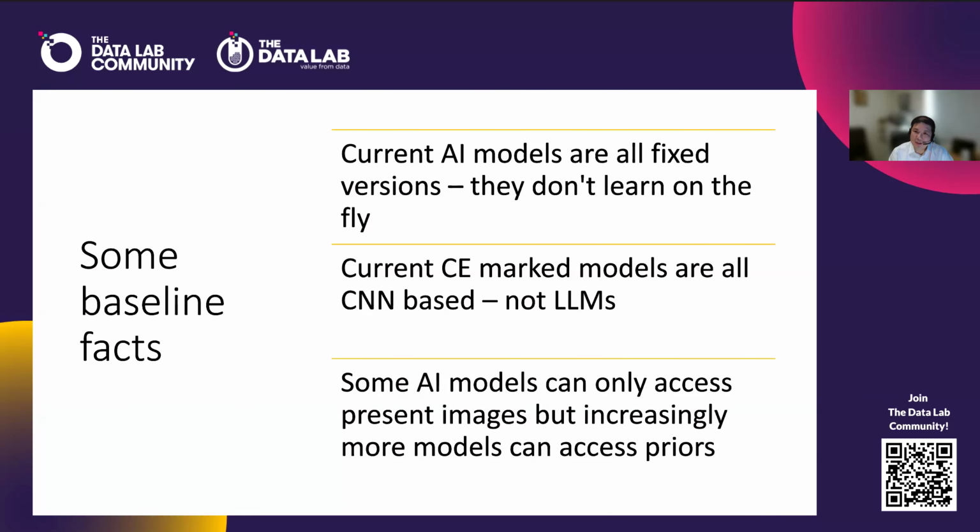And some baseline facts. The AI models are fixed. They are CE marked products. So CE marked, UKCA marked, or FDA marked. And these AI models are fixed versions. They don't learn. So it's not that when you say, oh, I've seen a mistake here, or you've overcalled this and you've missed this cancer, you can't tell the AI that. It's all a fixed model. And then you tell the company, and the company takes the feedback and trains more data into the model and releases your next version.